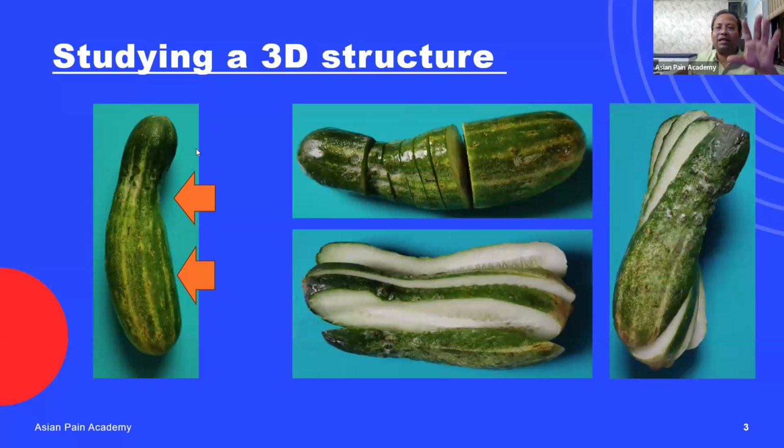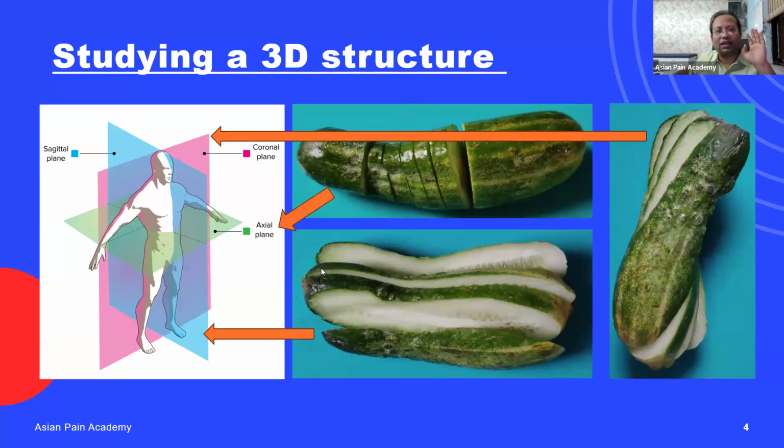Think of the whole structure as, say, a kidney. It is inside our body. We don't know what the structure is, how it looks, or whether there is a stone inside the kidney. So what may be the shape of the kidney? We will first see the cross section, and then we will imagine in our mind where this structure can be.